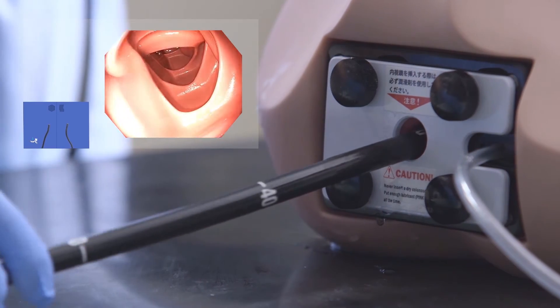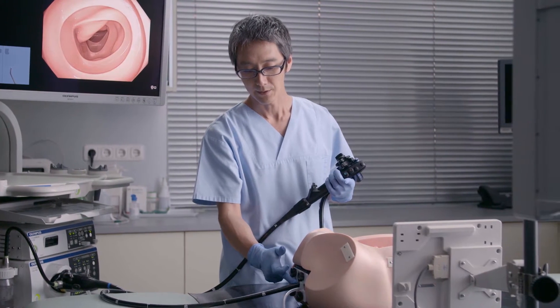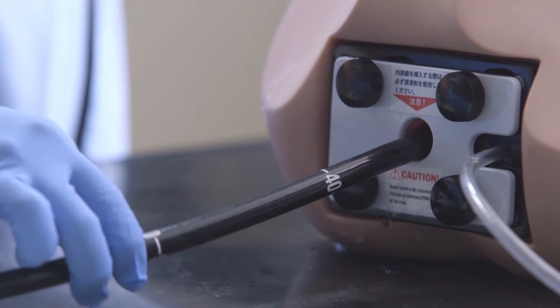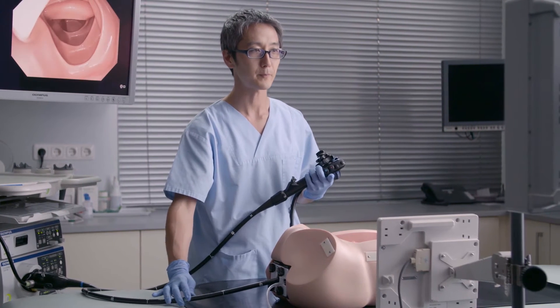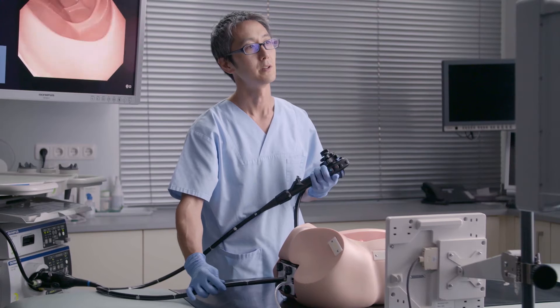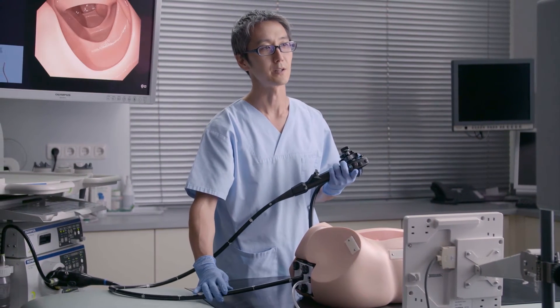The sigmoid-descending junction is usually at 30 to 40 centimeters, so you should always look at the length of how far you have the instrument inside the colon. Sometimes, water collection in the descending colon can also be a landmark to confirm that you are in the descending colon.